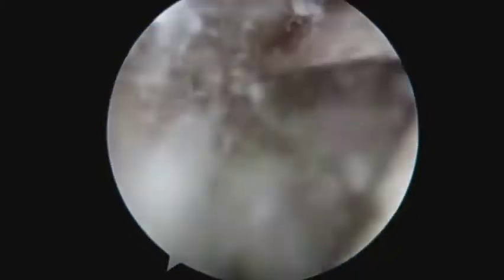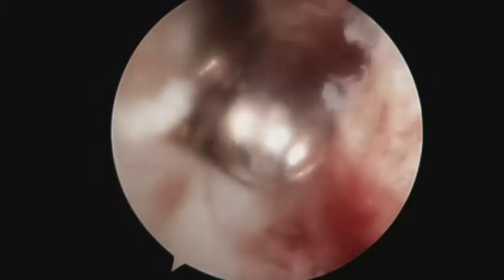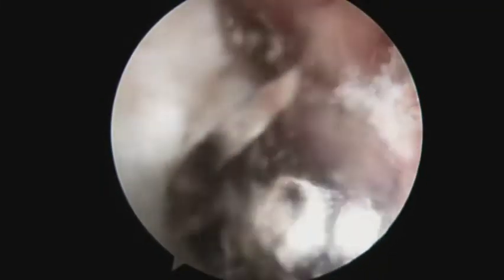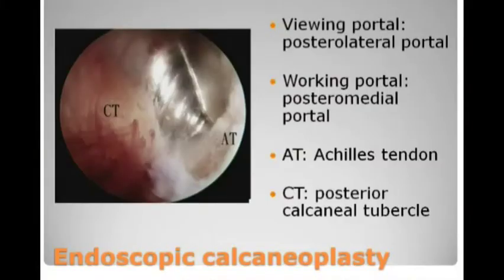Again, the posteromedial and posterolateral portals can be switched as the viewing and working portals. The posterior calcaneal tuberosity is resected down to the Achilles tendon insertion.